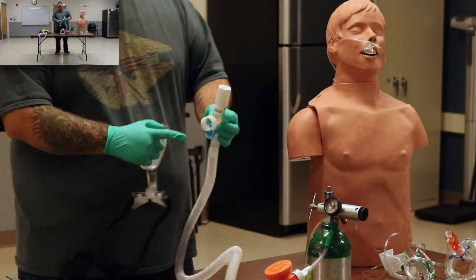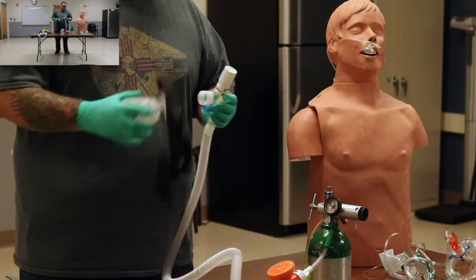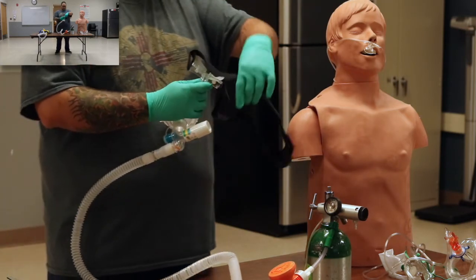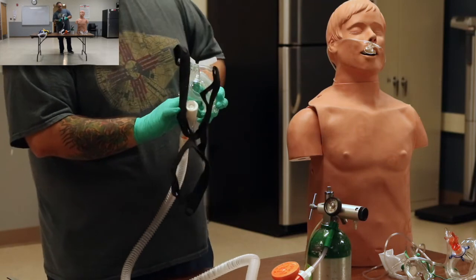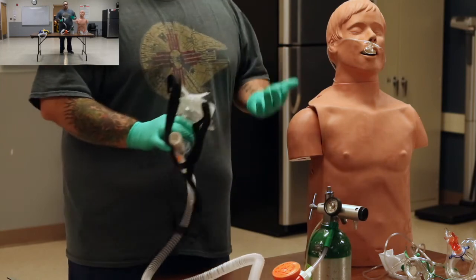We're going to connect our mask right here. This port right down here is for a nebulizer treatment to do inline neb. The straps are usually already connected. Same thing with the other devices as well. We want to make sure that we introduce the patient to it. We want to explain to them it's going to be uncomfortable. And before we get it secured in, we want to make sure that they're able to tolerate it.